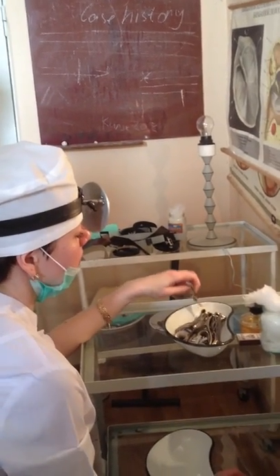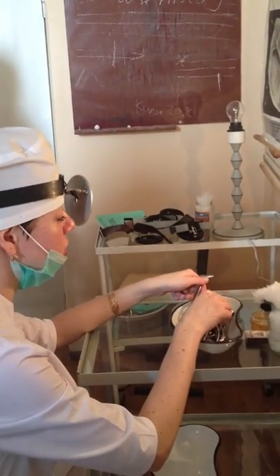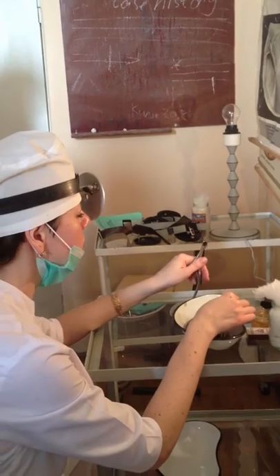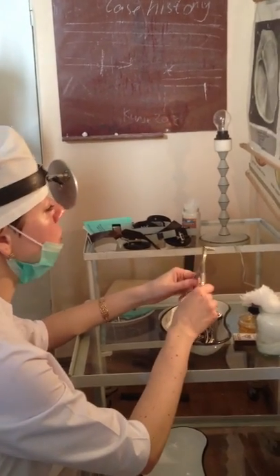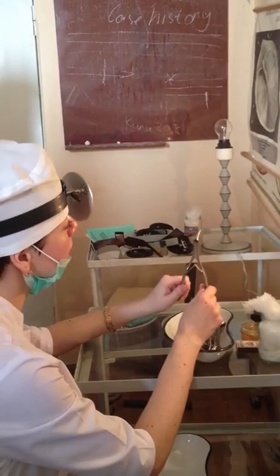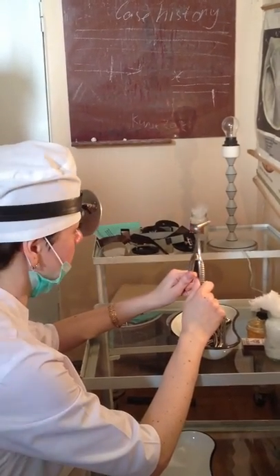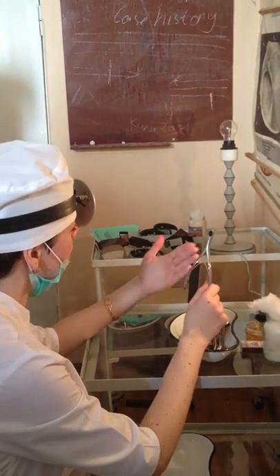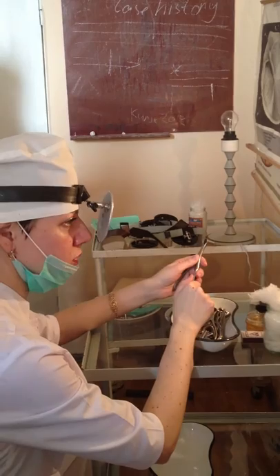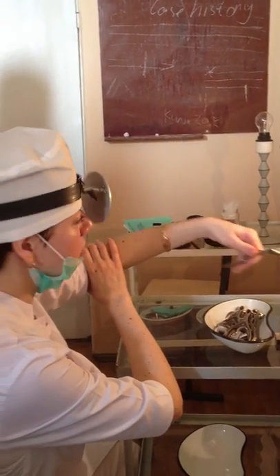Next is the instrumental examination of the nasal cavity. The name of this examination is called anterior rhinoscopy. For anterior rhinoscopy I use the nasal speculum. Place the nasal speculum in the open palm, put the nasal speculum in, and close it. This is the lower position — the elbow is immobile.